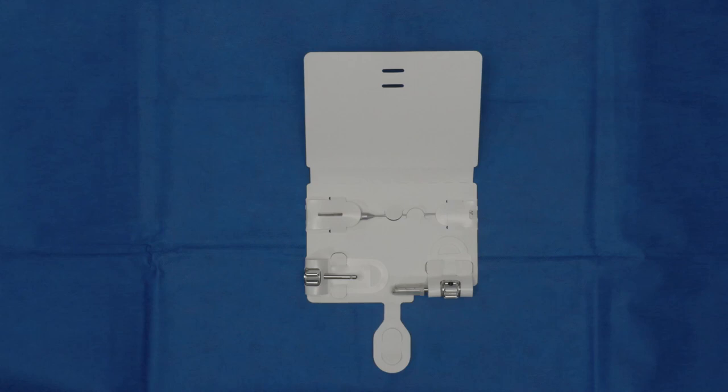Hello, my name is Dr. Molly Manley. I'm a hand surgeon in Akron, Ohio, and today we're going to talk about the OsteoAuger bone harvesting system.